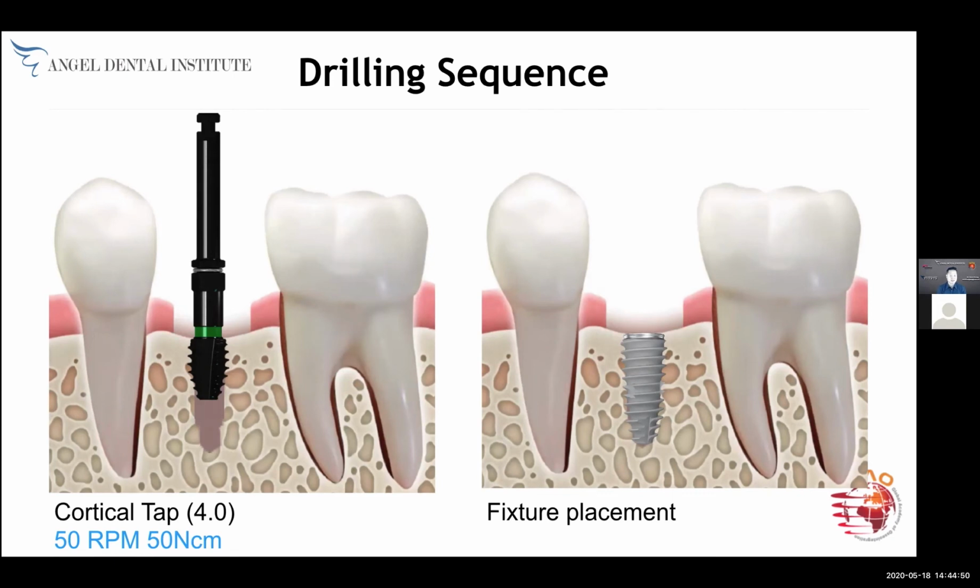This is where I told you that some doctors who are new make an error. They forget to reduce the RPM. They still have it in 700 or 800 RPM, and they put this in and step on the pedal, and this will just drive in. What happens is, if you did that, it'll lock in that drill. And if you try to reverse it out, it won't reverse out because there's too much pressure, okay?